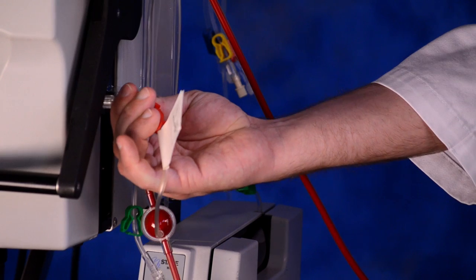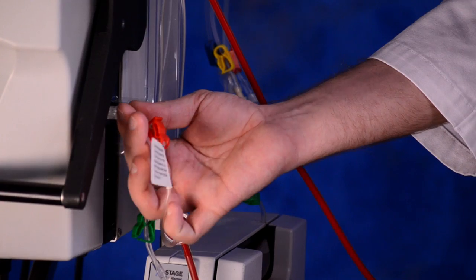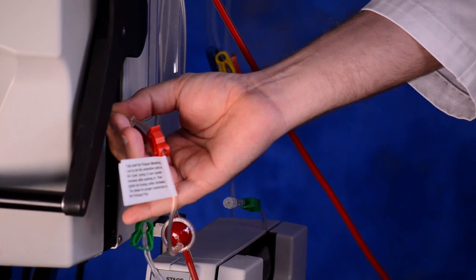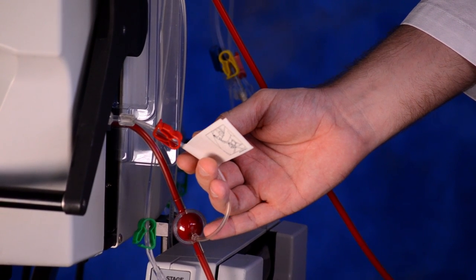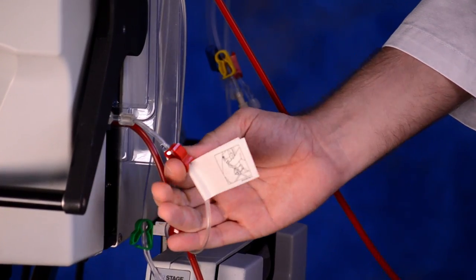Reconnect the access pressure monitoring line. Fully insert the access pressure monitoring line tip into the connection point on the cycler, turning one quarter turn counter-clockwise while pushing in. Then tighten the locking collar clockwise. This allows for proper connection of the pressure pod. Unclamp the pressure pod monitoring line.